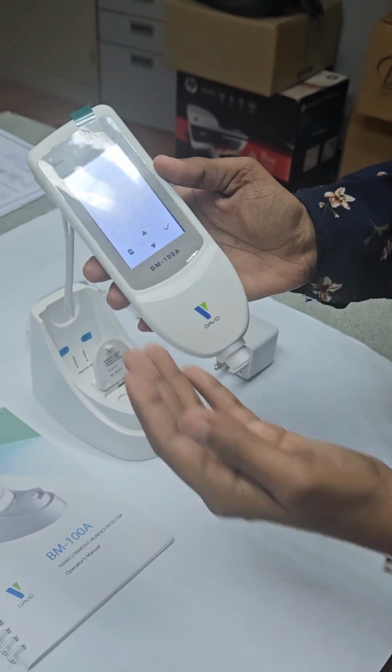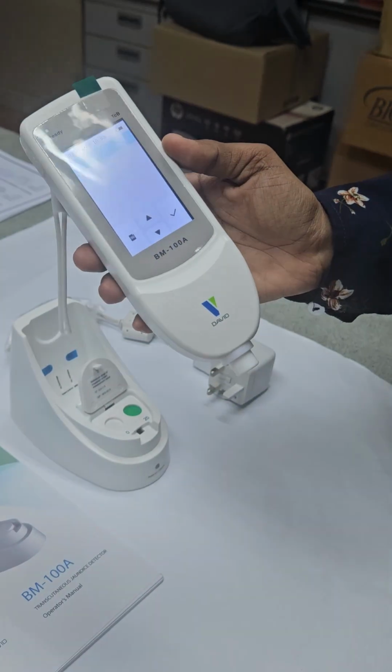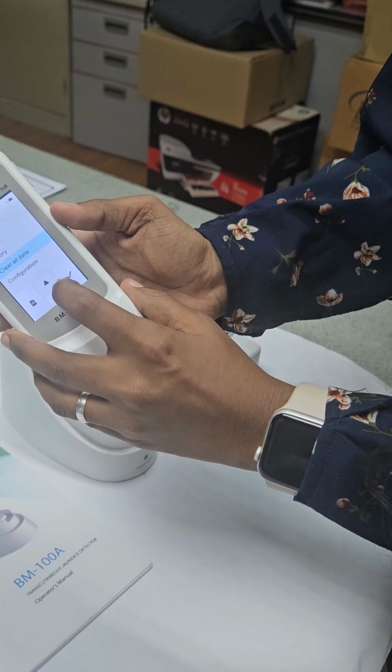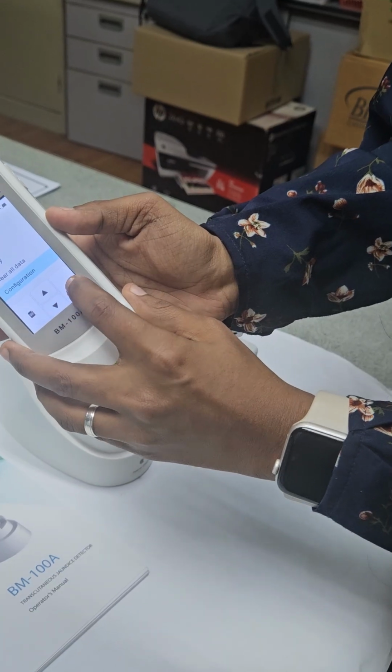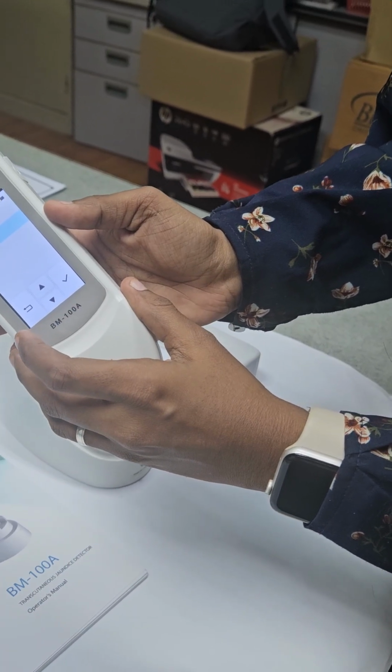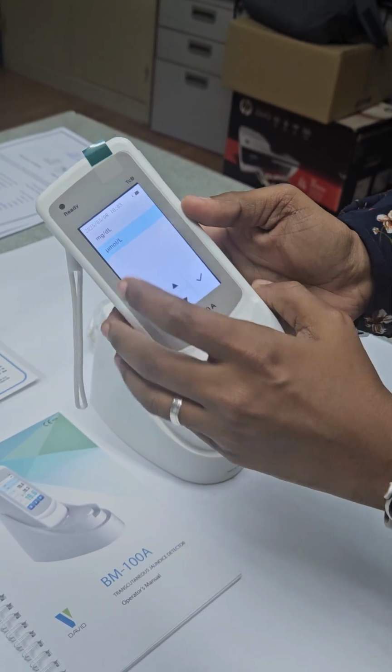History is for the patient data history. You can store 100 patients' data here. The result. It's clear all data. Okay. Configuration is like setting. Measure unit. There are 2 options: mg per deciliter and micromole per liter.